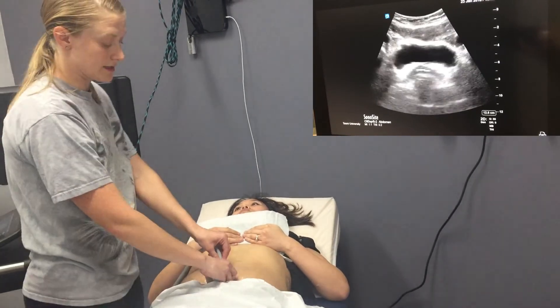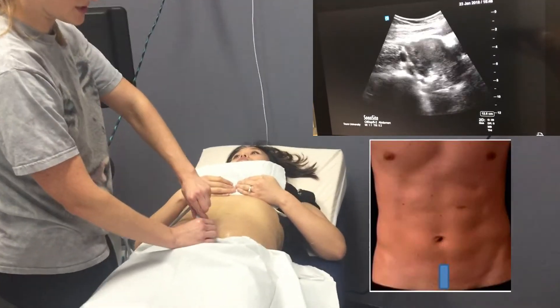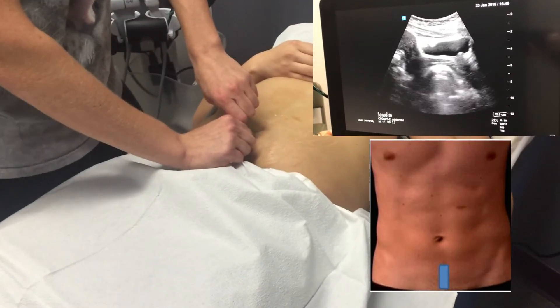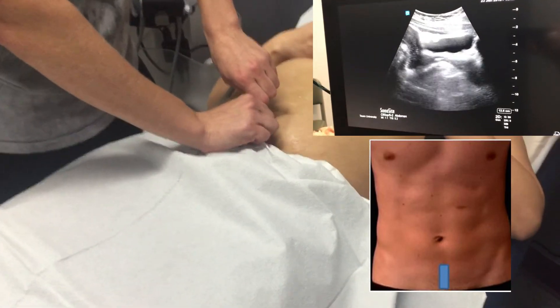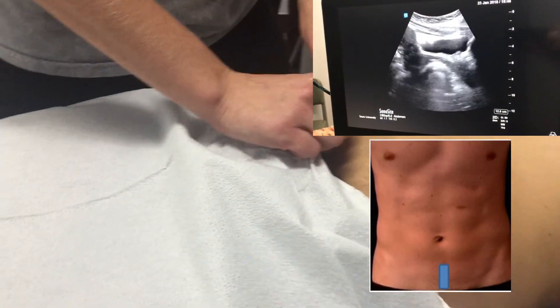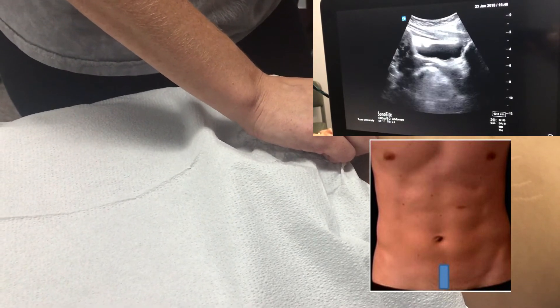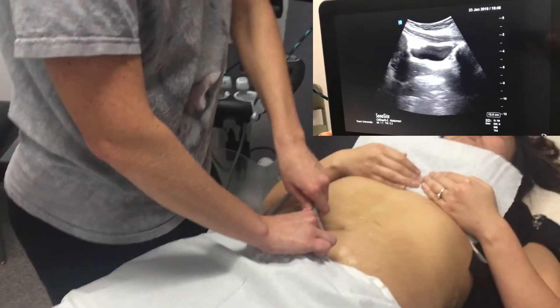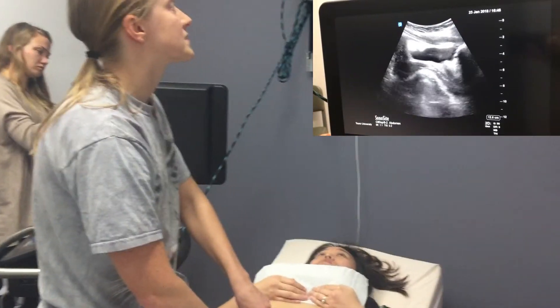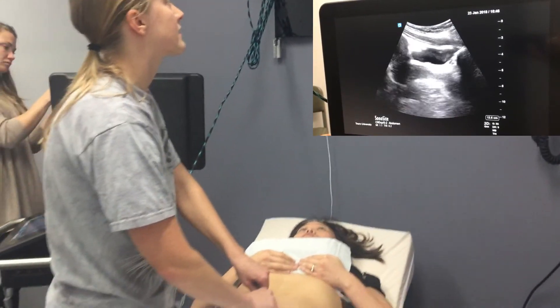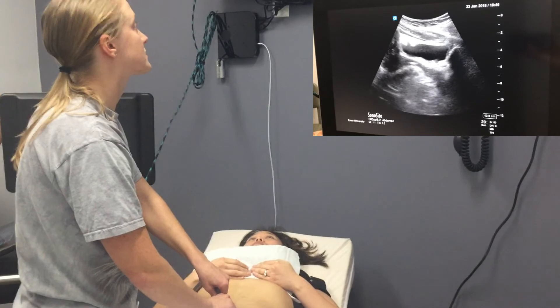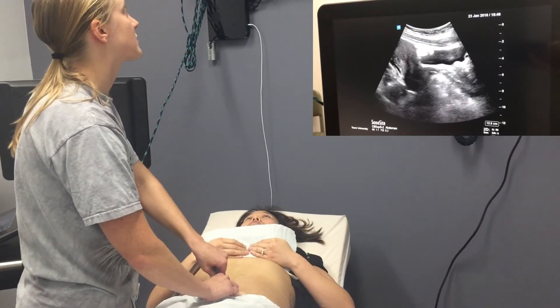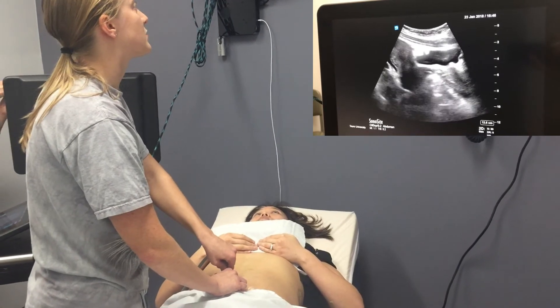I'm going to rotate 90 degrees so the indicator is towards the patient's head. Move down until I hit the pubic bone and then rock inferiorly. You can fan from left to right to make sure you visualize all the structures. The most dependent area here is going to be posterior to the cervix in the Pouch of Douglas. You also want to check between the uterus and the bladder.